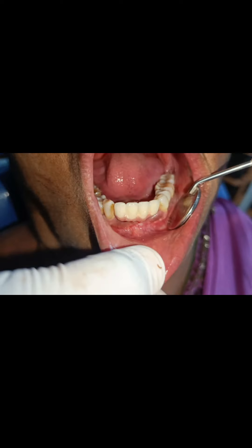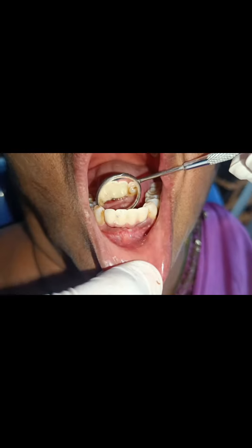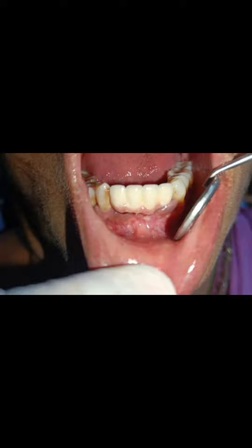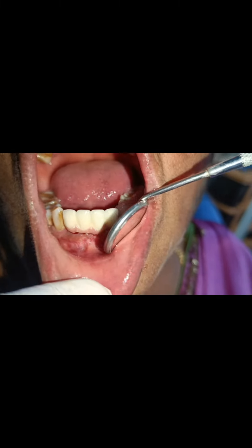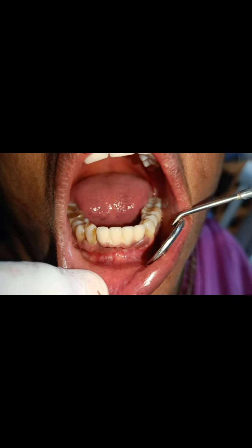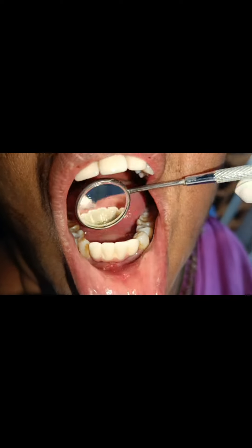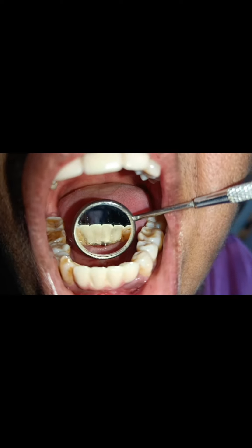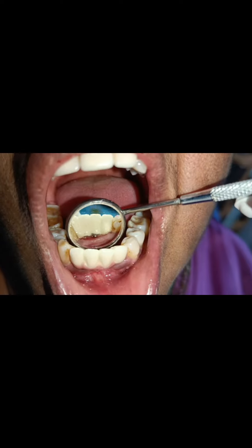This implant case was done around eight months back. As you can see, there's no peri-implantitis — absolute healing, and not much tissue shrinkage. This case was done immediately after extraction, without any temporary. There is slight recession in the lingual part, but that's fine.